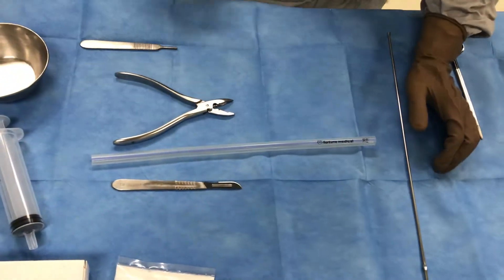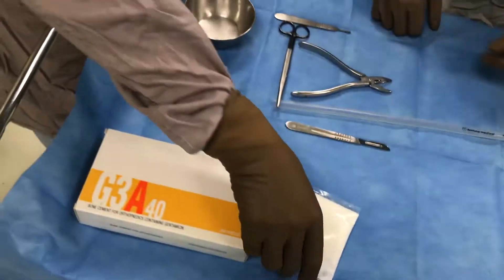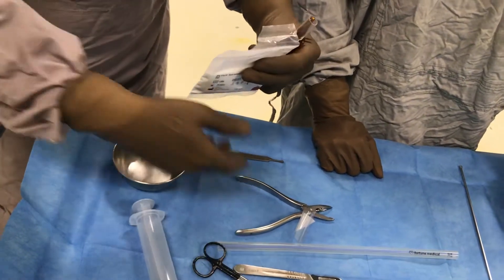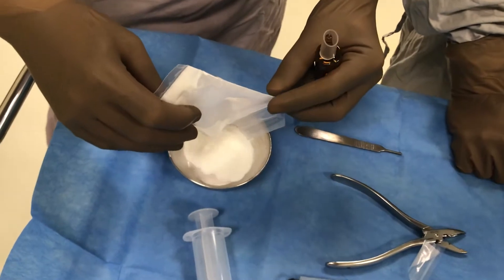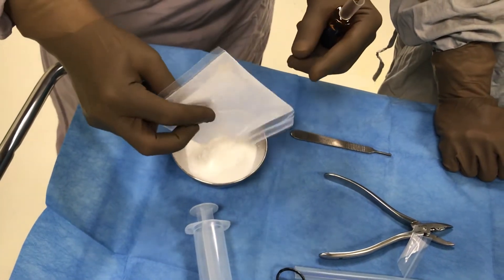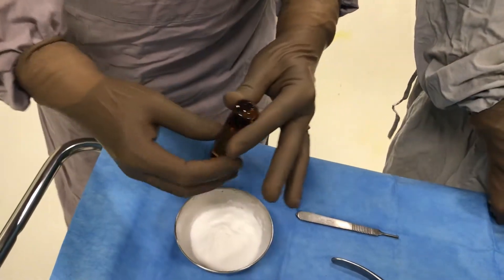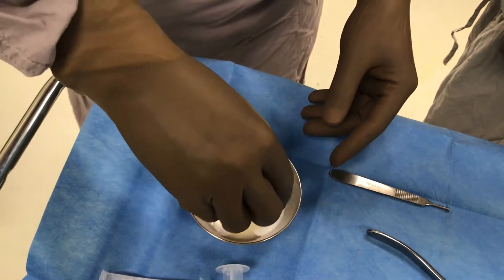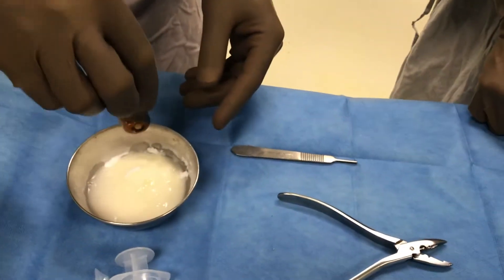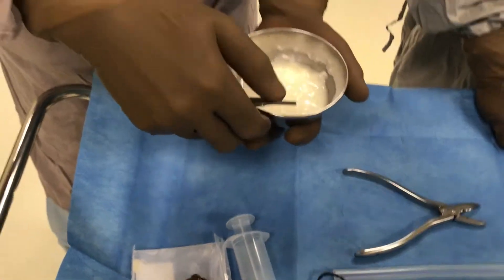We start off with mixing the cement. In this case, just for the preparation demonstration, we are not going to add vancomycin right now, but you can add 1 gram of vancomycin easily and it will not cause any disturbances in the bonding of the cement — it will give a good bonding mixture. Since this is a low viscosity cement, we will have a lot of time to work with it, and we will also demonstrate the antibiotic cement beads.